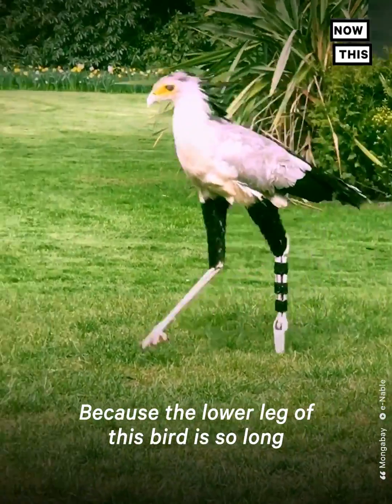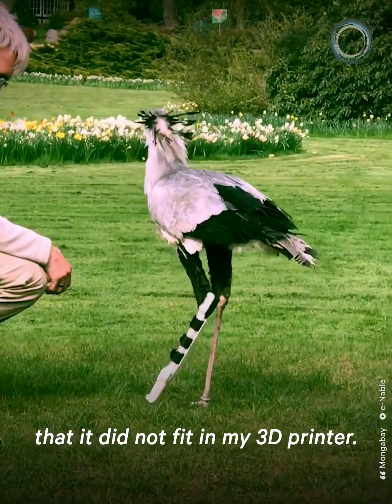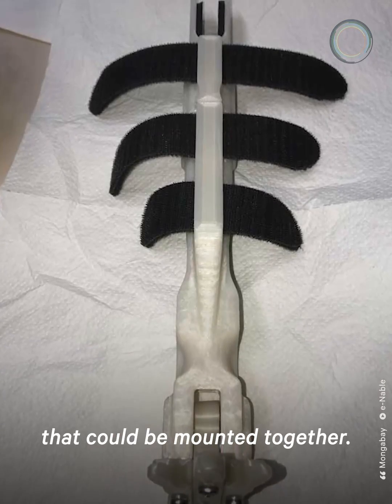Because the lower leg of this bird is so long that it did not fit in my 3D printer, I had to split the whole prosthesis into two pieces that could be mounted together.